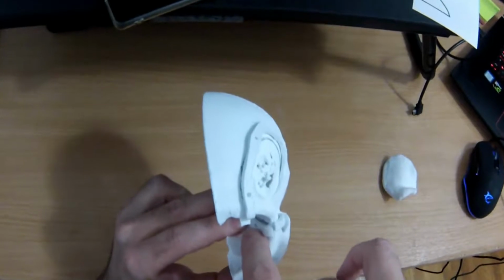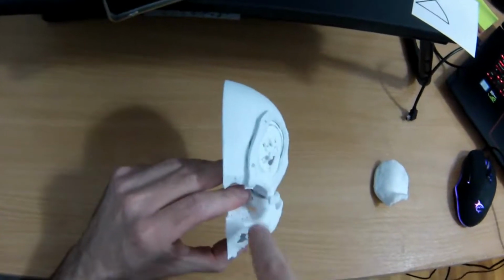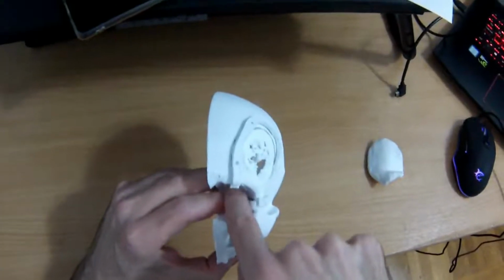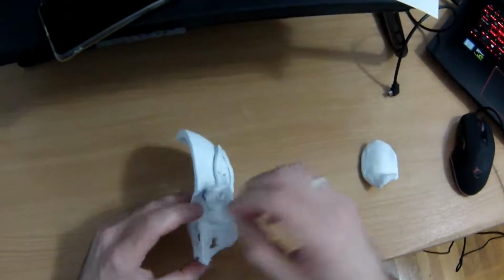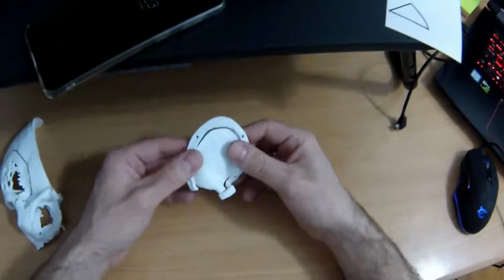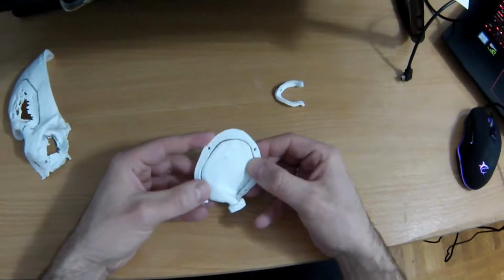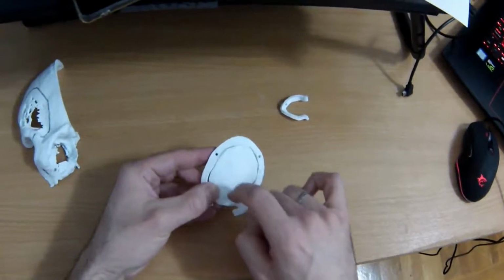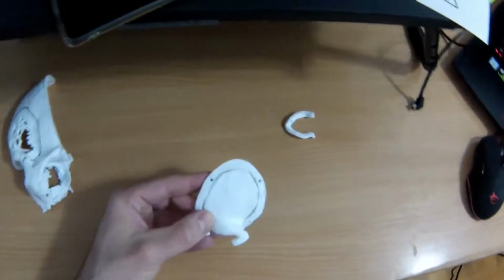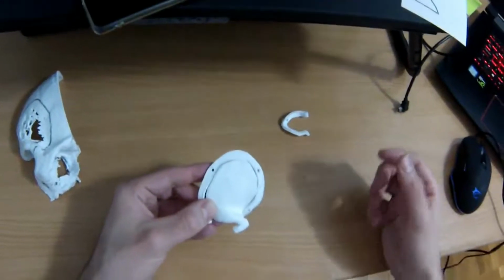So I will try to make a hole at this angle over here, like that, maybe the same for the more distal hole over here. And if you try to compare, this is a graft, it fits the cutting guide. Okay, I marked the places of the holes for the screws, and the diameter is 2 mm. So that's the plan.